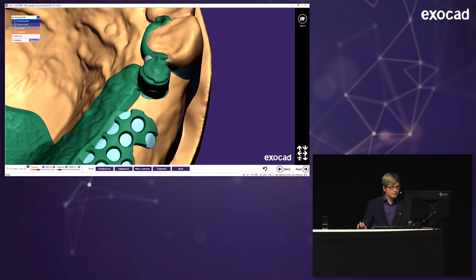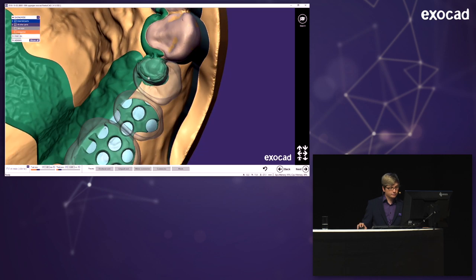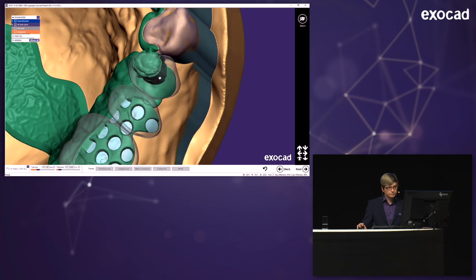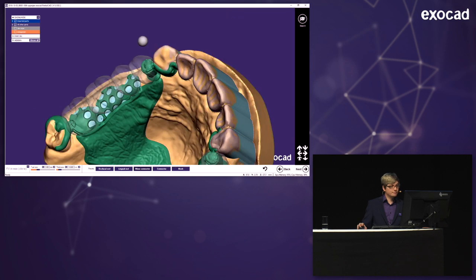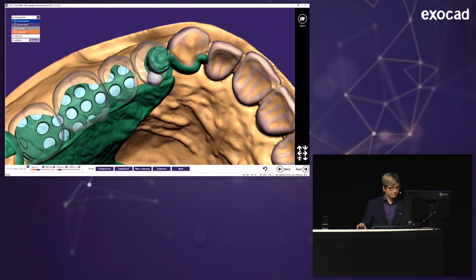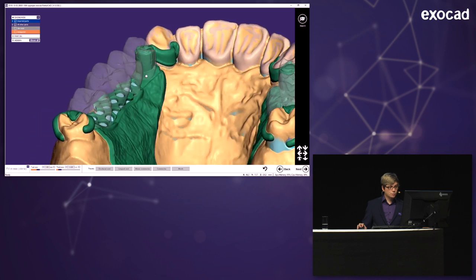OK, just like that. And now I'm adding some material here where later the metal dummy will be placed. I'm just drawing a kind of plate underneath of it. Same one for the other metal dummy. And I'm done with the step.